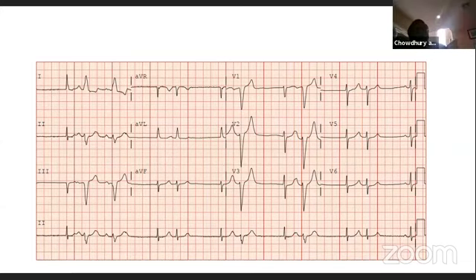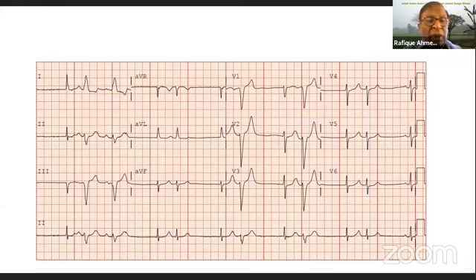So do you think that it changed the axis and became wide, and you would think it's still aberration? Yes, this still is. Question is, if you look at the presence of, especially, the first two QRS complexes being wide with presence of a P wave and the constant PR relation, that's a supraventricular rhythm. Now more than before, I am very, very confident about it. So this is basically a supraventricular rhythm being conducted with a left bundle aberration.